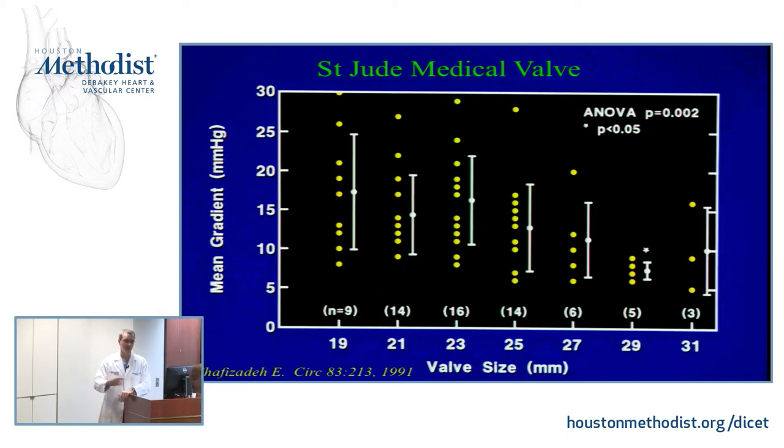So if you're taking the history, you're scanning the patient, and they present you with a card, it's very, very helpful if you write down both the type of valve and the size of valve. Personally, my view, once they've had a transplant, you don't need to keep writing that down. That still shows up on our reports. AVR, MVR, transplant, we don't need to see it anymore after the transplant. But gradients and areas are very much associated.